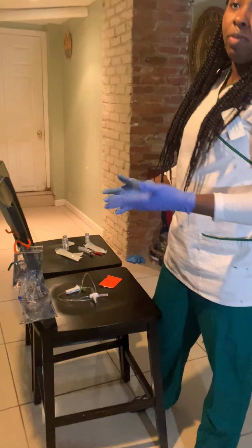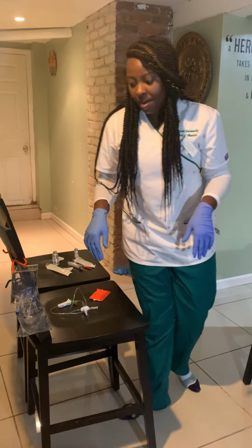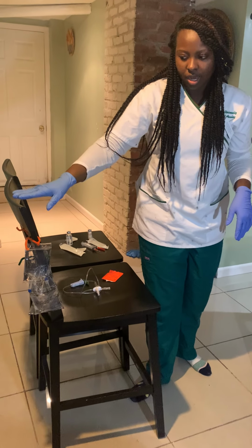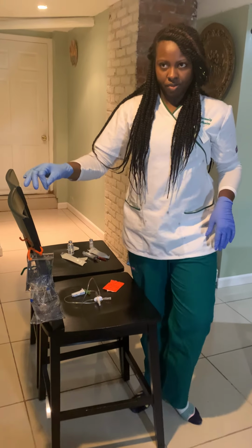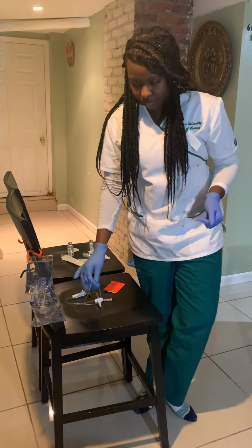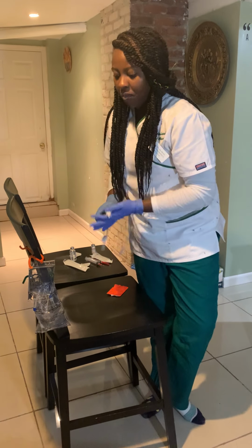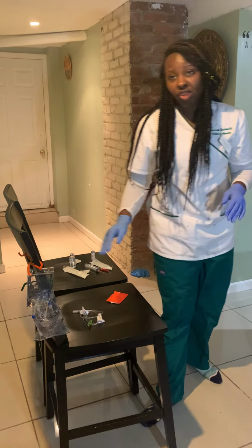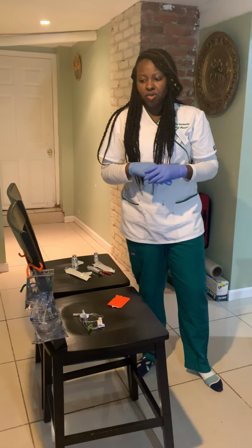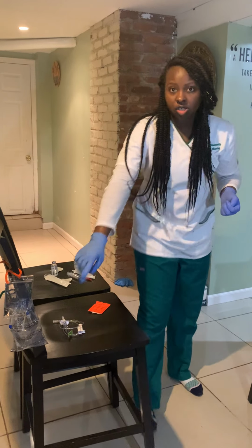So in this case, we don't have one, so I'm going to just let you know that I did it. I'm then going to set my drip rate to 100 ml per hour. And then I'm going to unclamp. This was connected, by the way. I unclamped. Now, once I've done that, my infusion rate is set. The piggyback is at the top, and the other one is still below.